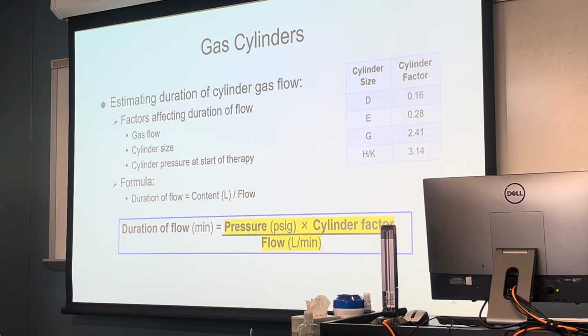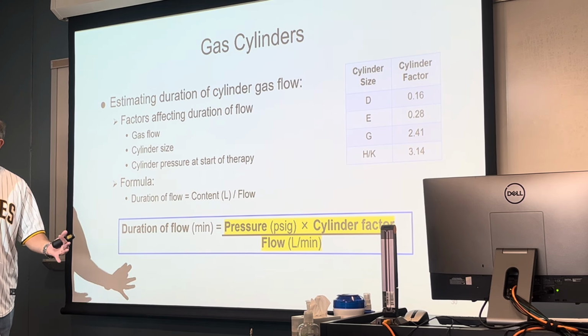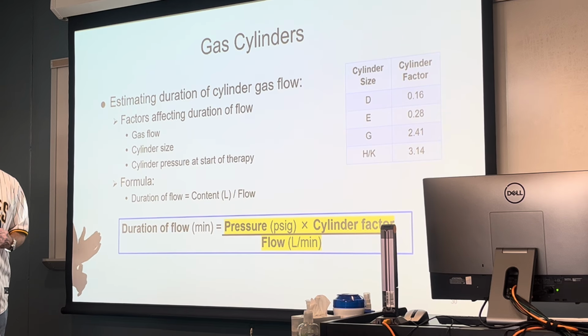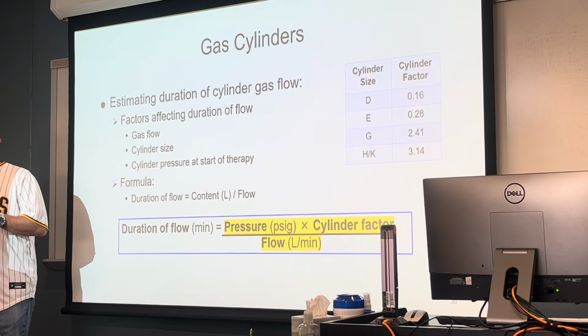And trust me, this is a calculation you can teach your patients when they want to know, well, how long is this thing going to last me? I plan on going to a doctor's appointment today. I plan on leaving that appointment, grabbing some lunch with a loved one, visiting for a little bit, and coming home. Will this single tank last? Well, how much time do you think you're going to need to be out? Always have a little extra, a little play. We know traffic may take us so long to get to campus, but when we're stuck in traffic for another 30 minutes, that time could be extended.